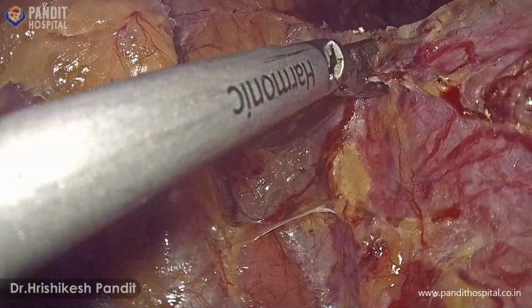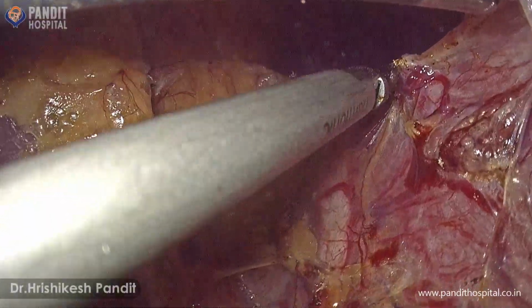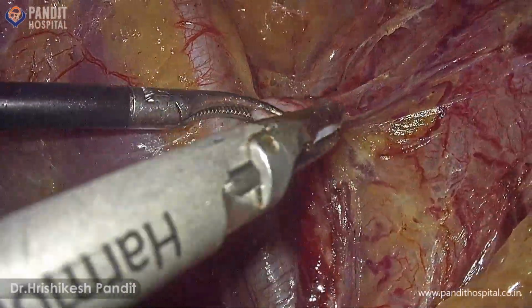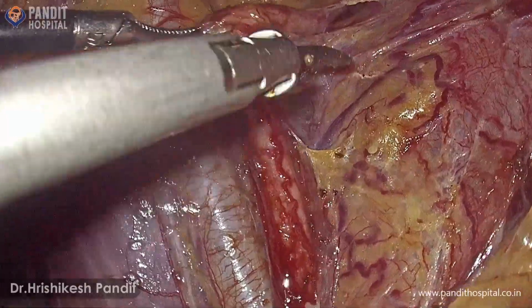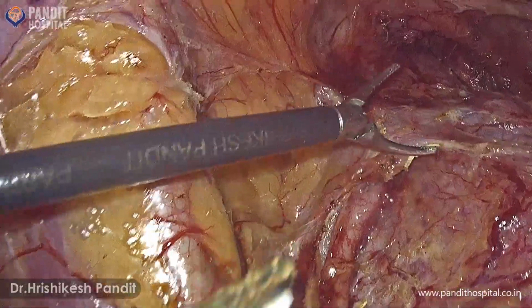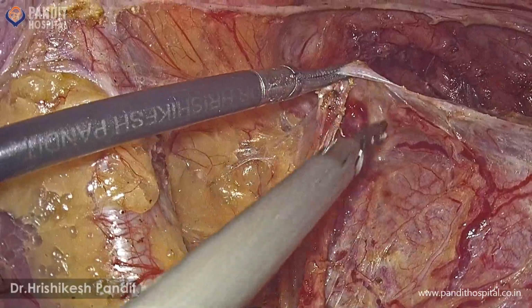Ureter divides the pararectal space into medial and lateral pararectal spaces. Medial pararectal space is also known as Okabayashi space. This is important because it carries the hypogastric nerve and inferior hypogastric plexus, which is important for voiding of bladder and rectum and also for sexual function.